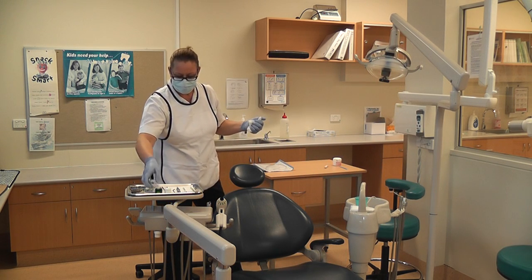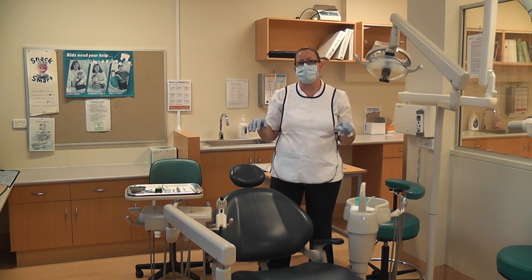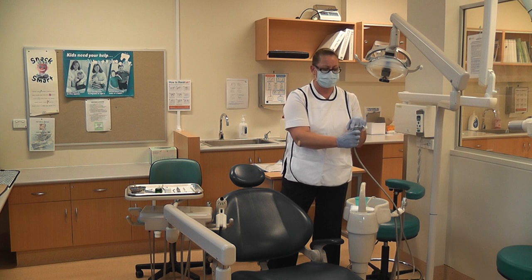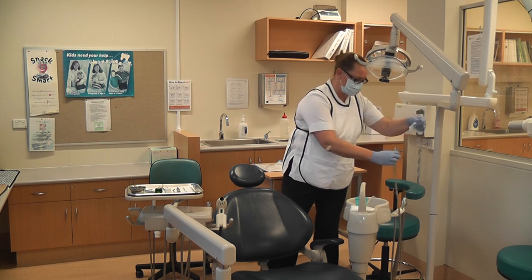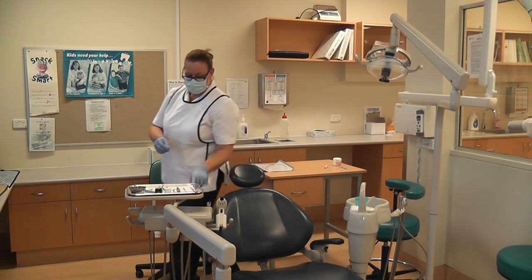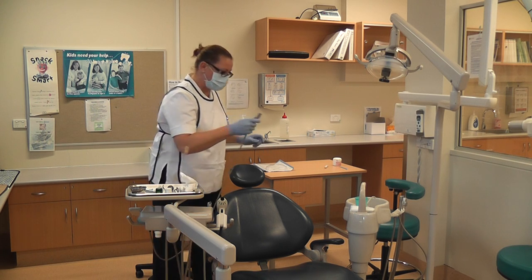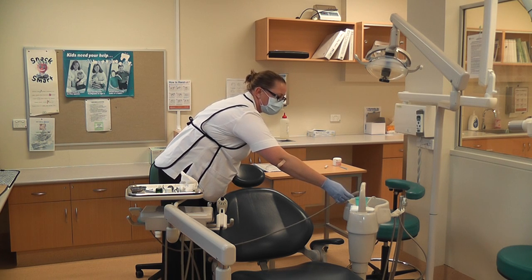If you were using a high speed, then that needs to be purged. Here in our practical area we do not have the sterilising tablets that go in the bottles, so you need to actually run through any water lines you've used for 20 seconds just to clear out the lines, then you can remove any tips. That includes triple syringes, your high speeds, and your water line such as your ultrasonic. You can remove the main portion and then run it into the sink, purging those out for 20 seconds.